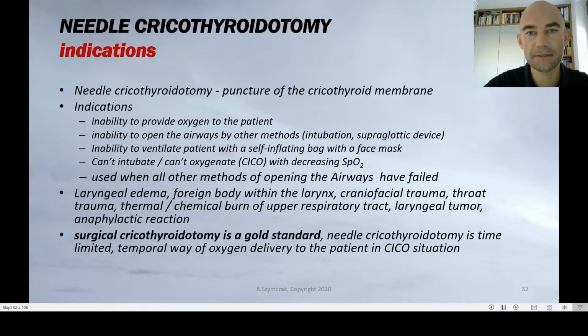In most cases, patients at the emergency department that need needle cricothyroidotomy are the ones with anaphylactic reaction, burning injury to the upper airways, and facial trauma. Remember that the gold standard procedure in the situation of cannot intubate, cannot ventilate, when the saturation is going down, is the surgical cricothyroidotomy.